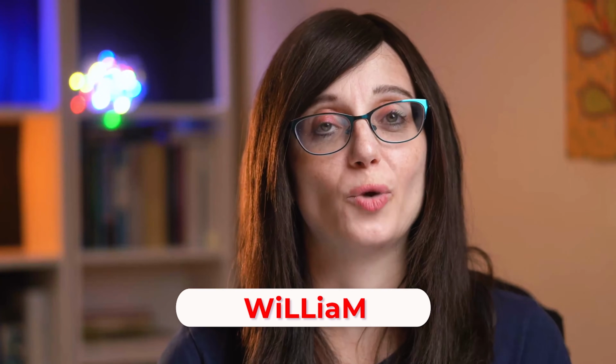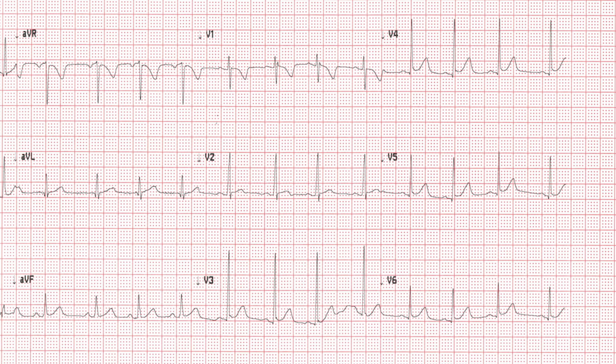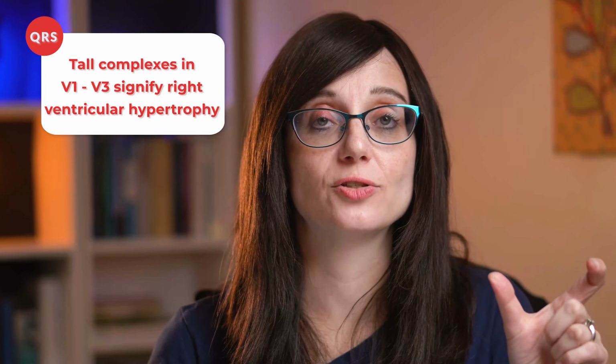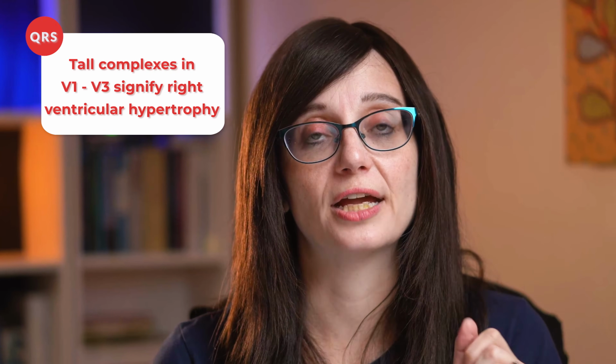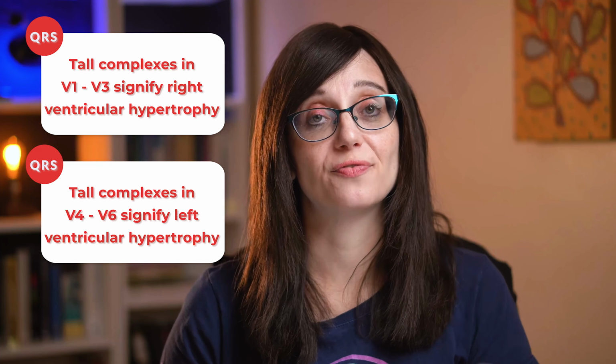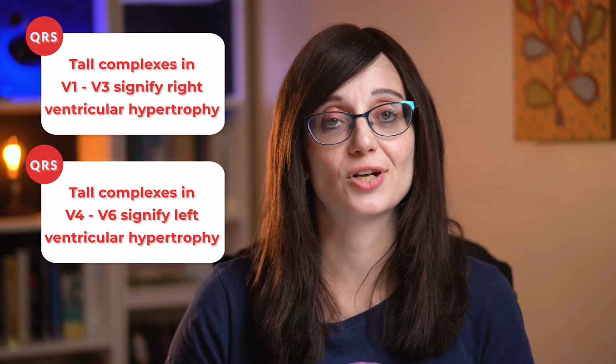In bundle branch block, you're looking for the pattern that you've probably heard about, which is William or Marrow. And then you want to look at the height of the complexes across the chest leads. If you've got tall complexes in V1 to 3, then you're looking at right ventricular hypertrophy. If you've got tall complexes in V4 to V6, then that suggests left ventricular hypertrophy.